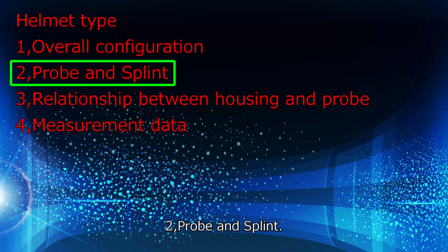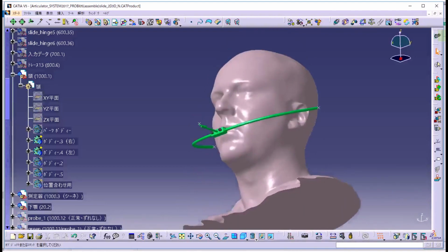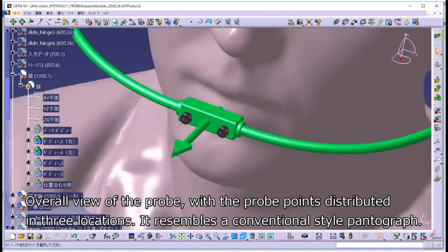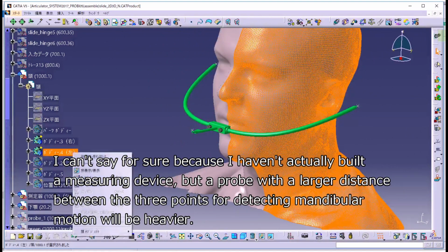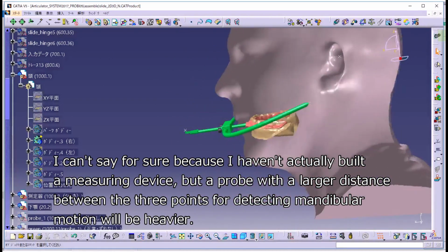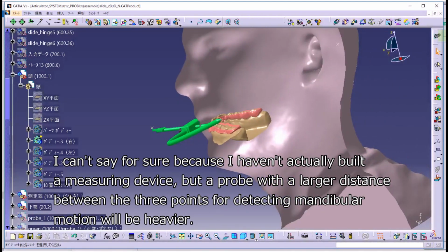2. Probe and splint. Hide the helmet section and housing section. Overall view of the probe, with the probe points distributed in 3 locations. It resembles a conventional style pantograph. I can't say for sure because I haven't actually built a measuring device, but a probe with a larger distance between the 3 points for detecting mandibular motion will be heavier.